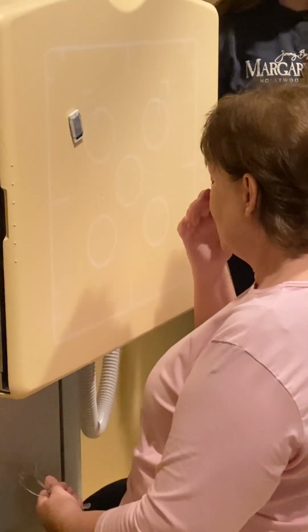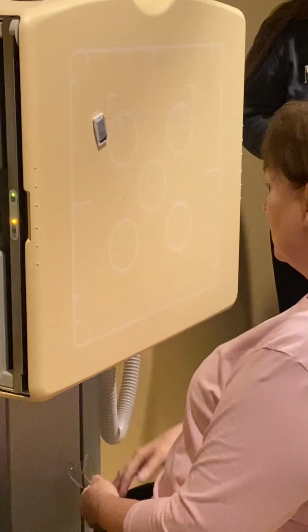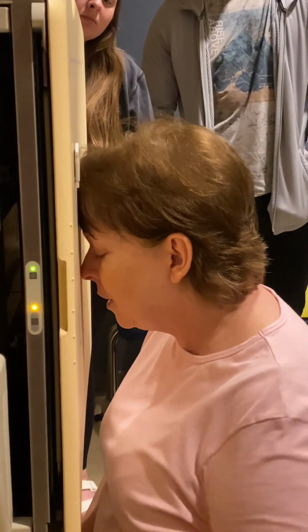All right, so let's just say your body's back here, nose and forehead down, OML perpendicular. So you lean in. Yep, nose and head is down, OML. I don't know if it's perpendicular or not. Hopefully it is. So that's one way. You can say, okay, criteria met. I got my positioning done. But look at the head. The head or the skull is tipped.